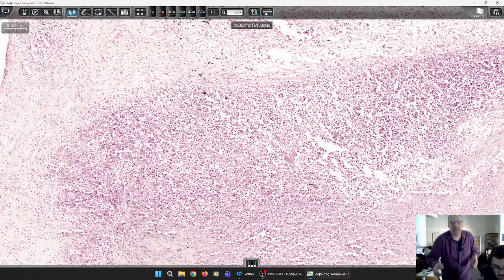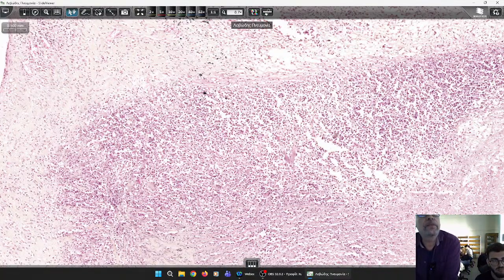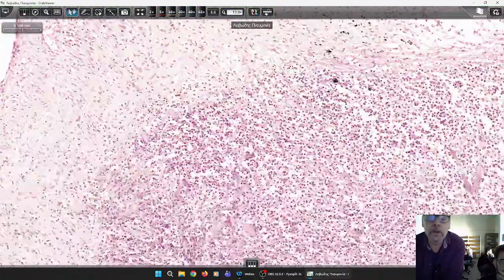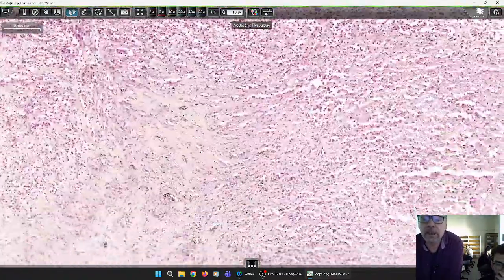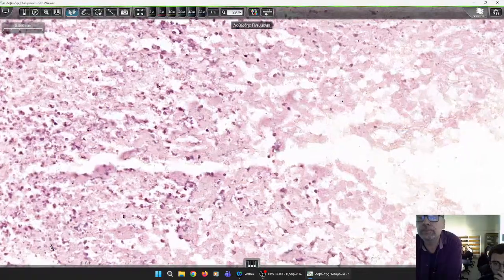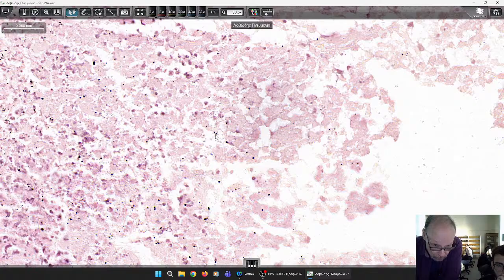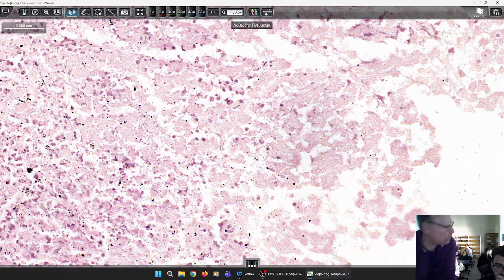As you can see here, this is the area where we see vessels. There are no vessels in the area of the pus where the dust is. You see, this is the dust. These are not whole nuclei. These are remnants of nuclei. These are necrotic cell remnants. So the only way is surgery. When an abscess is formed, the only way to treat it is surgery.